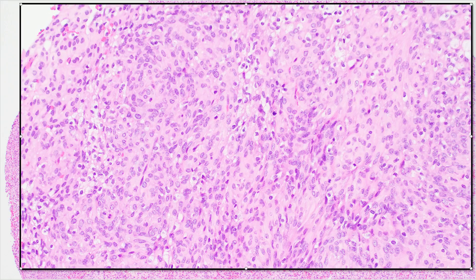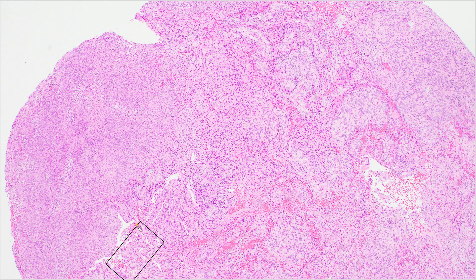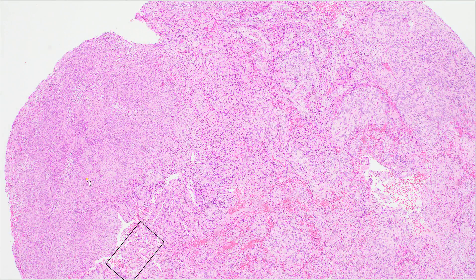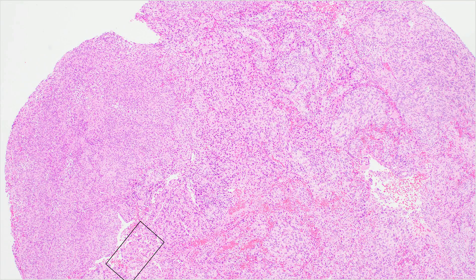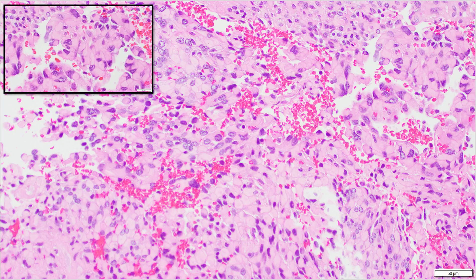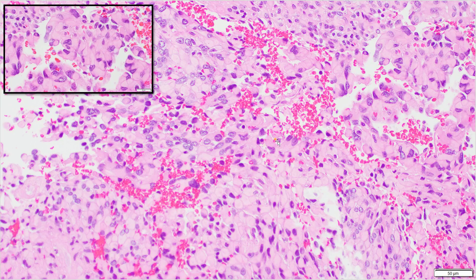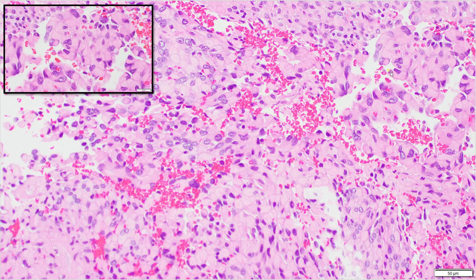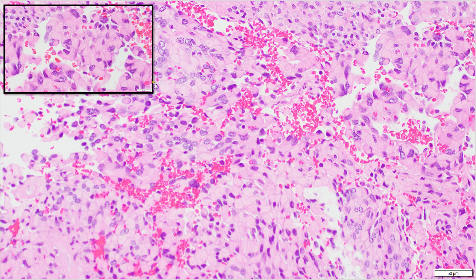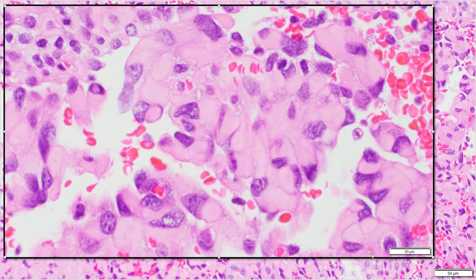When we go to other areas of this tumor — looking right in here — we'll see that there's a different appearance. Here is an up close and personal view of this tumor, and we're going to look a little bit closer where this inset is. I'm just going to make this inset a little bit larger.